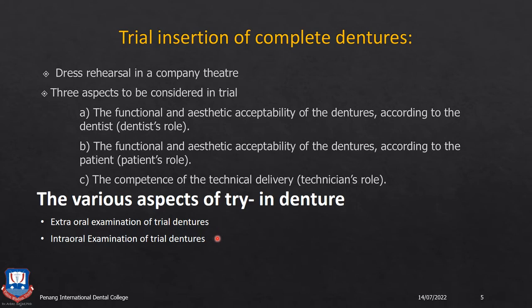Because remember, many of the patients who come to you for denture insertion belong to a profession where they are active speakers, they may be active social activists, they may be an imam of a masjid, or they may be a pastor, or they may be a priest, or they may also be teachers or headmasters and principals. So speech is one of the very important reasons for which many patients come to you to seek the complete denture treatment. So it is very vital that your teeth arrangement or the teeth setup does not impede the patient's pronunciation.